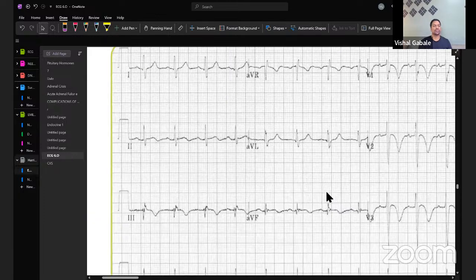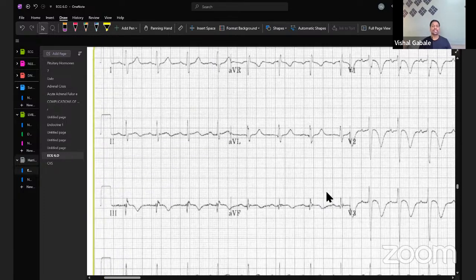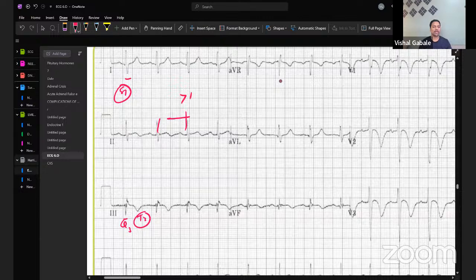Similarly, see this ECG now. Is there S1Q3T3 in this ECG? Can anybody tell quickly? So incomplete RBBB means you will have RBBB with narrow complex. Somebody else. Okay. Yeah, this is exactly. See, S1, Q3 is there and T3 is also there. So this is about the pulmonary embolism, guys. And look at the heart rate. It is almost like more than 100 in this patient.